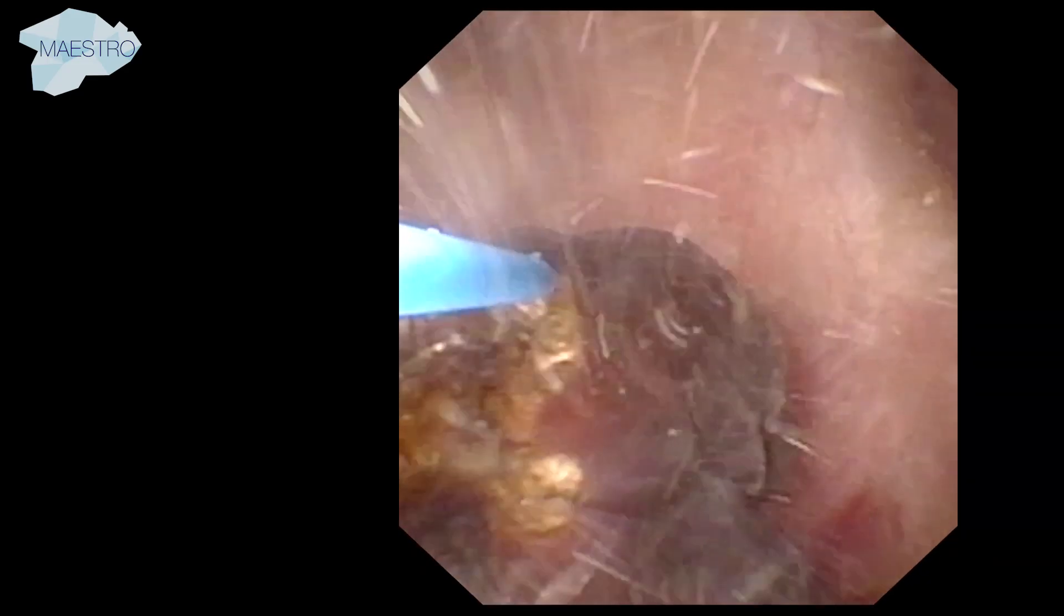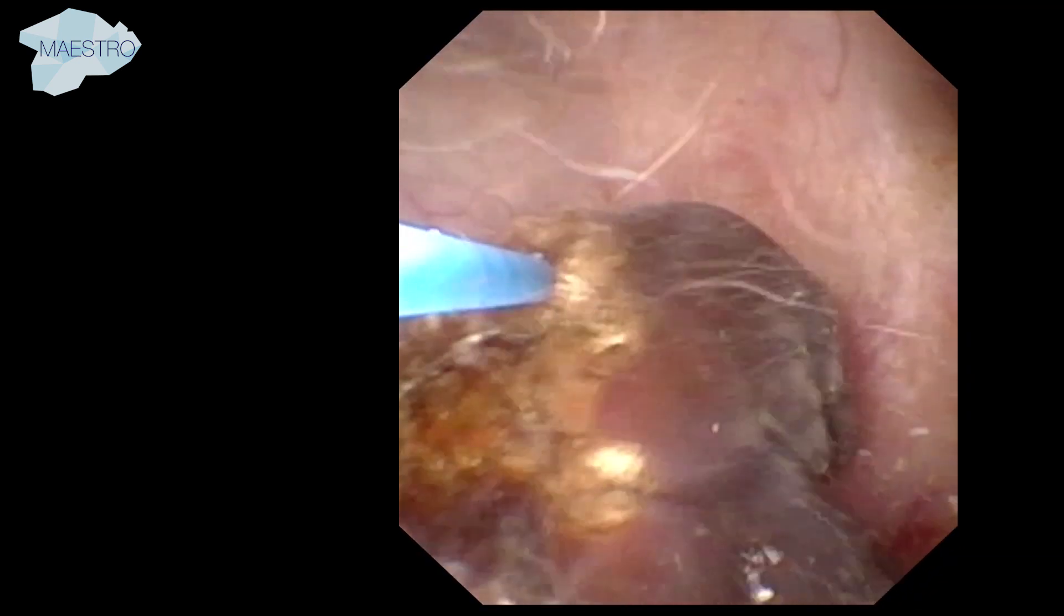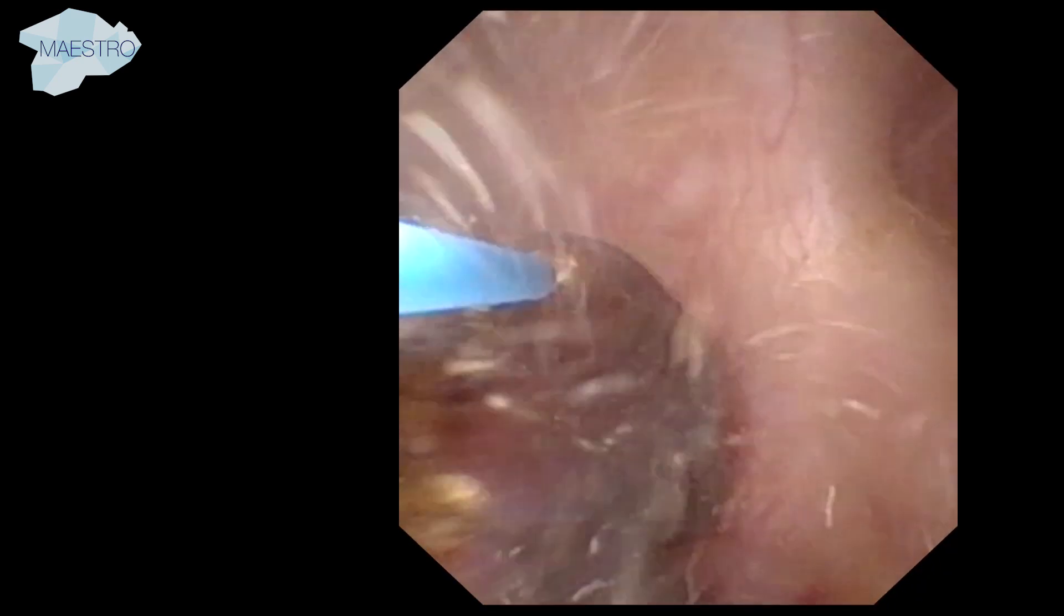High frequency and low energy result in a dusting effect on the stone. The stone dissolves into stone dust, leaving almost no larger fragments behind. The surgeon should work from the outside to the center of the stone.